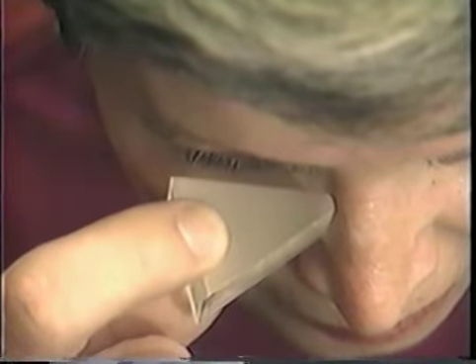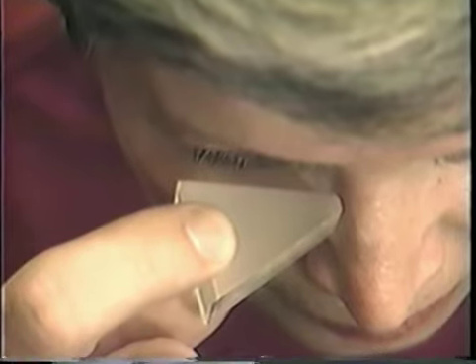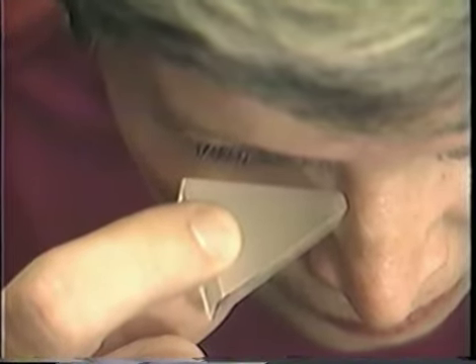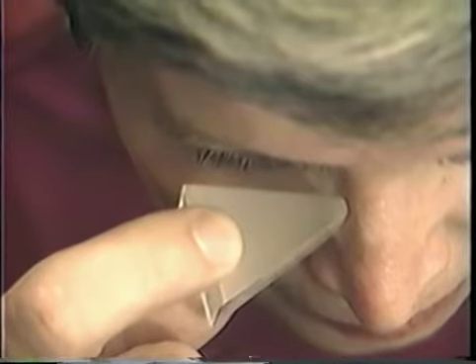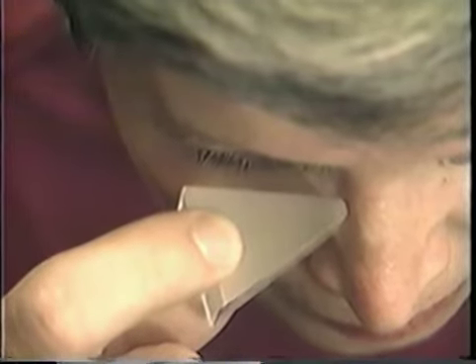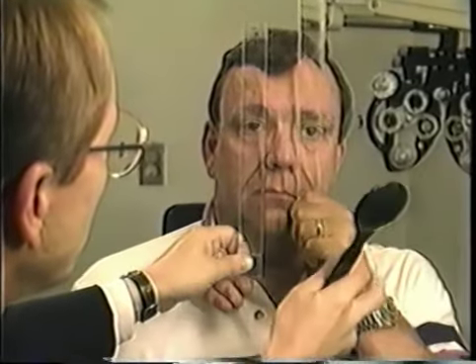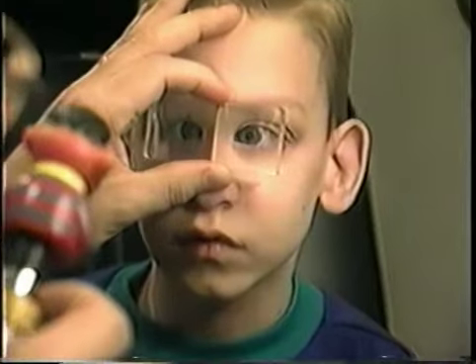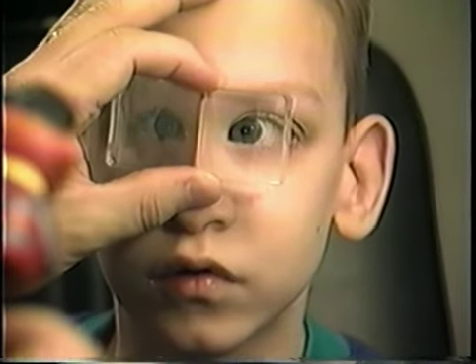Always hold the prism with the apex pointing in the same direction as the eye is deviating. American-made prisms are calibrated so that it's most accurate to hold them with the rear surface in the frontal plane. It may be necessary to hold prisms both horizontally and vertically to completely neutralize the shift. This test can be performed in all gaze positions. When measuring large deviations, do not stack prisms together. It is more accurate to place a prism in front of each eye.